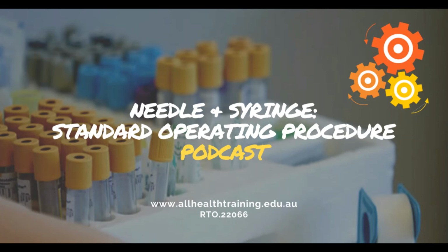You need to discard your needle straight away with only one hand. Pull back the plunger slightly to prevent any blood drips. Insert the needle into the sharps container hole at the top. Lock it in and rock back and forth to lever the needle off the syringe. Remove the lids off the tubes and carefully decant the blood into each tube, ensuring you take note of the fill lines and the order of draw. Discard the syringe.